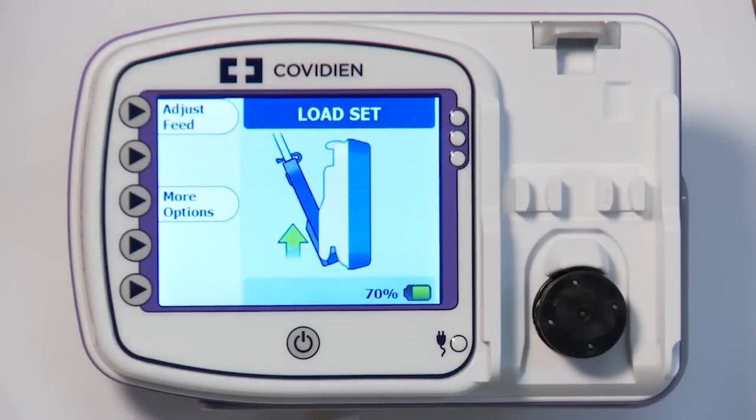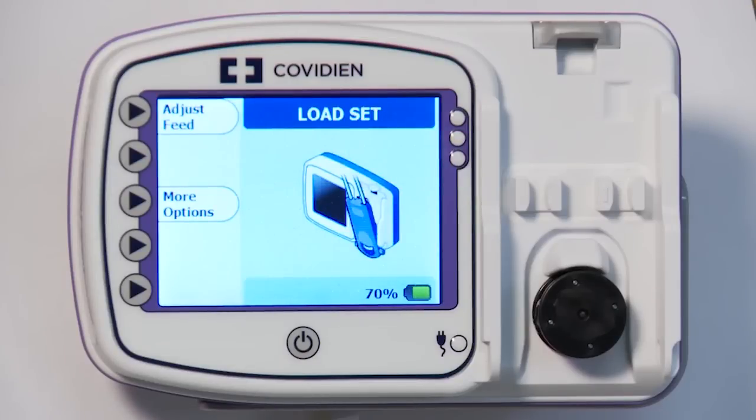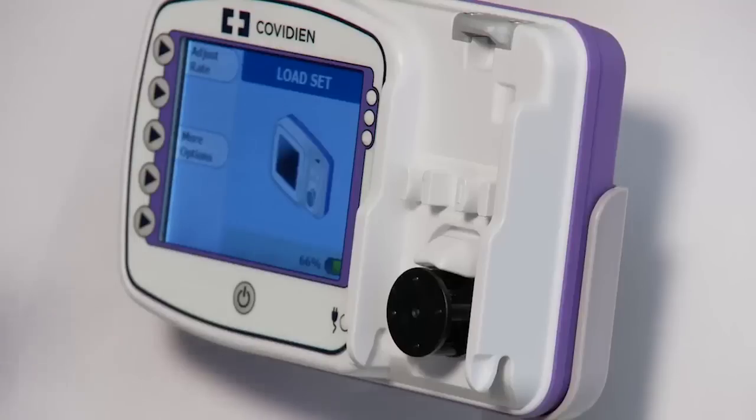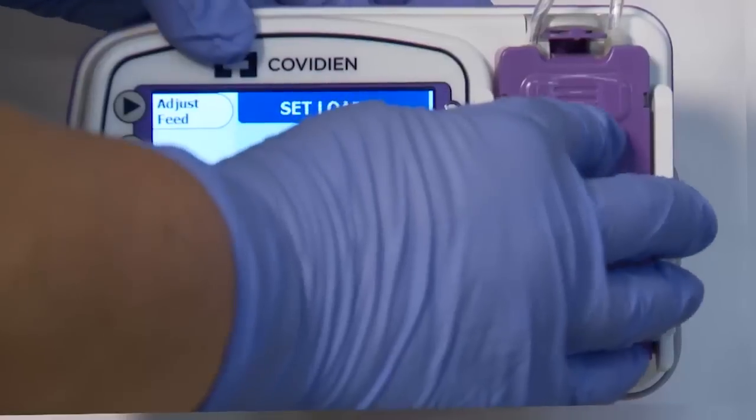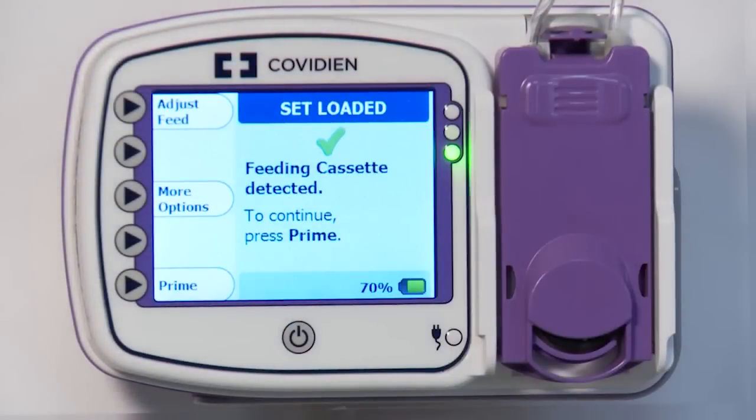Next, you will see the Load Set screen. Follow the animated instructions on the screen, sliding the bottom pegs of the cassette up into the slots, then locking the top into place. The Set Loaded screen will confirm that the pump has correctly identified the feeding set.